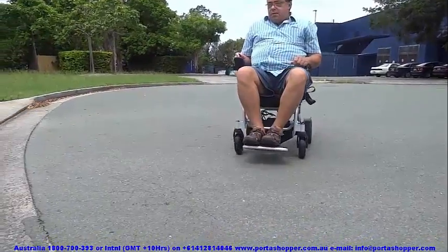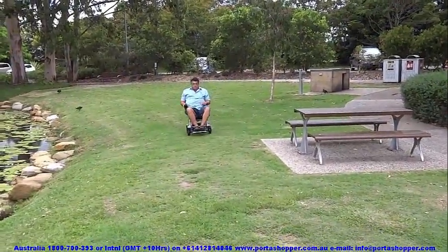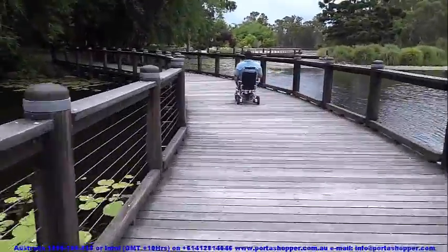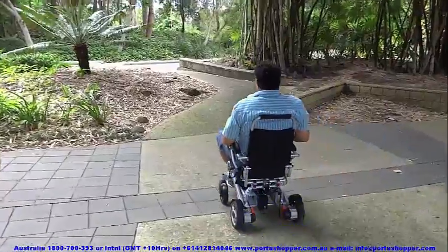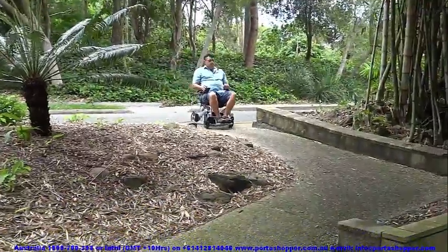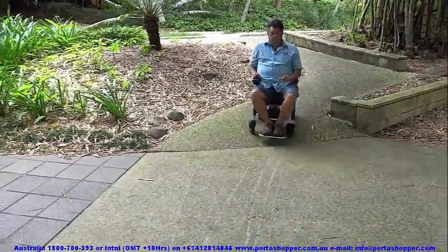Our next model is the Portashopper 3 Mark III, slightly heavier at around 23kg or 50lbs with battery included, and more rugged — designed for children and adults weighing up to 120kg or 264lbs. It also has the easiest folding mechanism of all the lightweight electric wheelchairs out there, making it an excellent choice if you are going to rely on others such as cab drivers and caregivers to fold it up and lift it into the car.